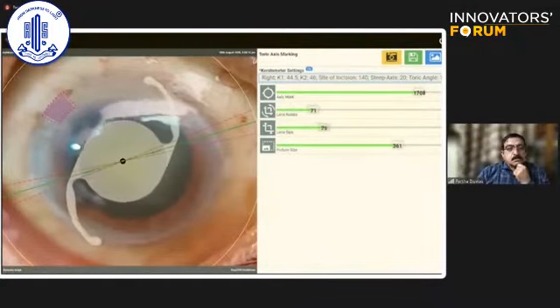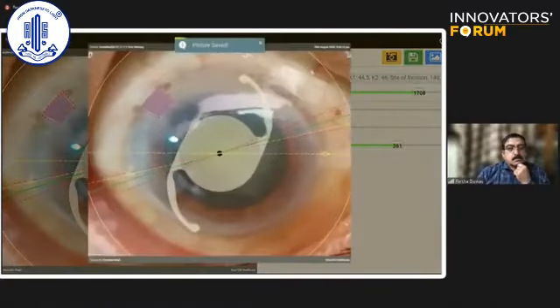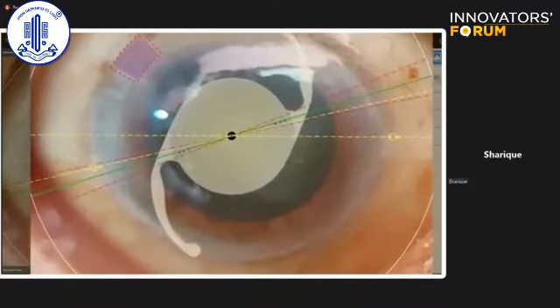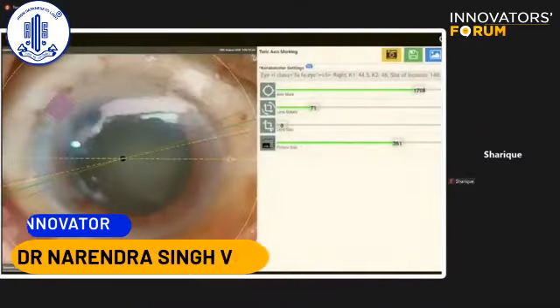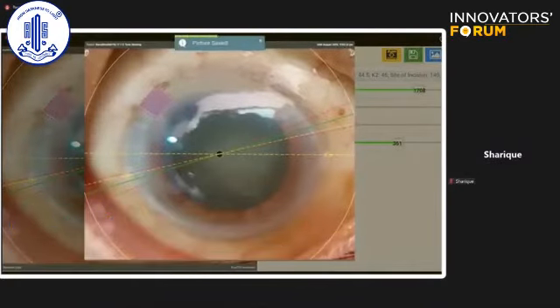You can also display lens silhouette in the axis of alignment. There is also an option for marking 3 landmark points as yellow lines. The axis of these lines is displayed at one end. Save the picture. It can then be magnified and rotated as desired. Picture can be displayed on mobile, tablet or other display devices in the OT for axis alignment reference. Picture without lens image can also be saved and used as a reference to visualize iris structures.